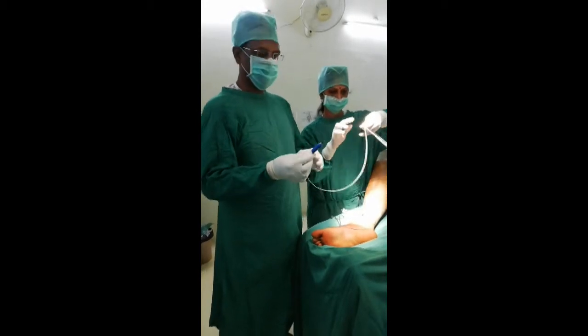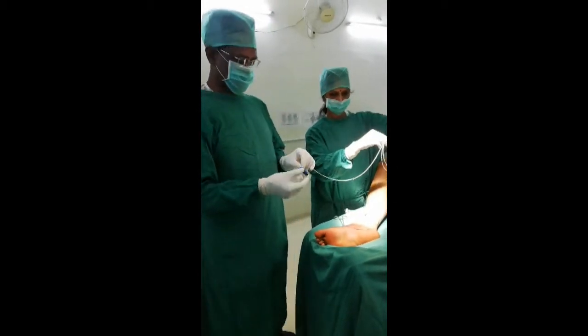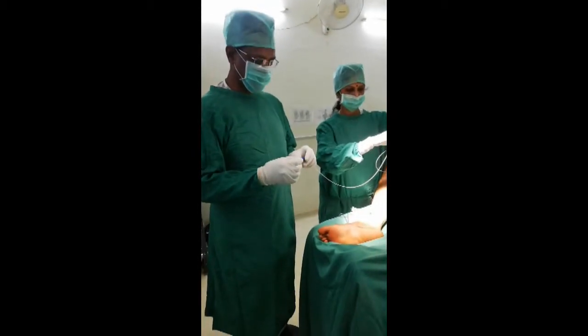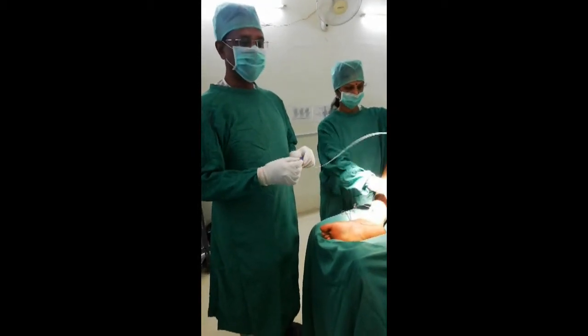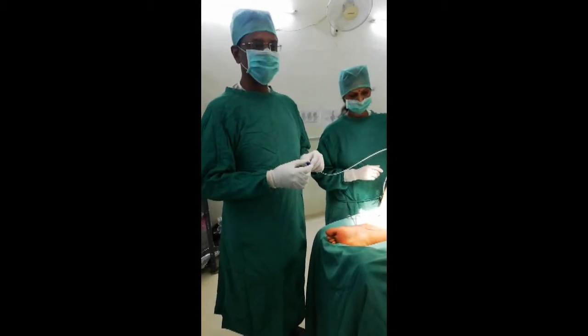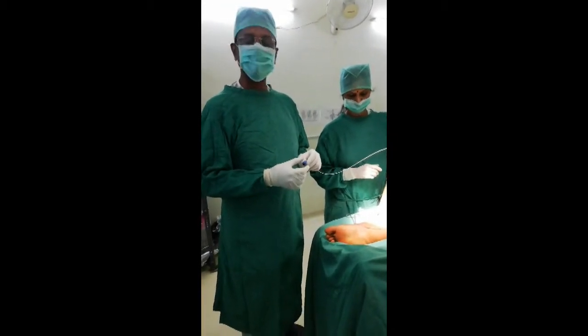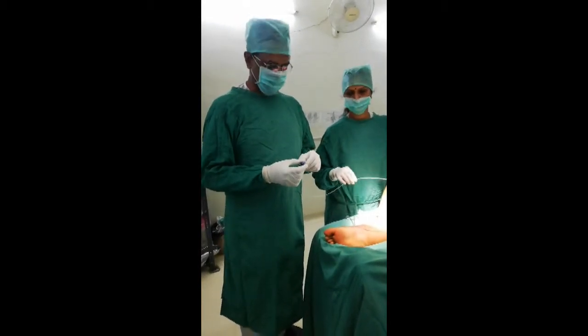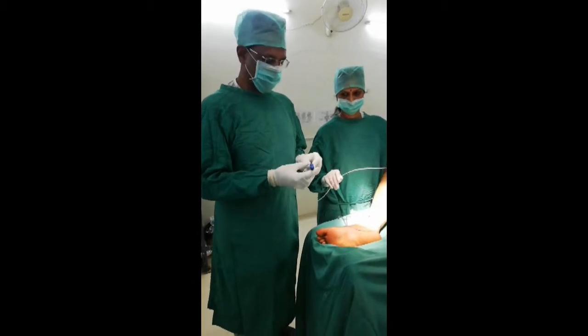So that it gives a very good burning capacity in the vein — no scope for error. And as it is a biolytic machine, it is highly standardized: what we set in terms of laser power and laser energy interval is what we get from inside, unlike other machines.